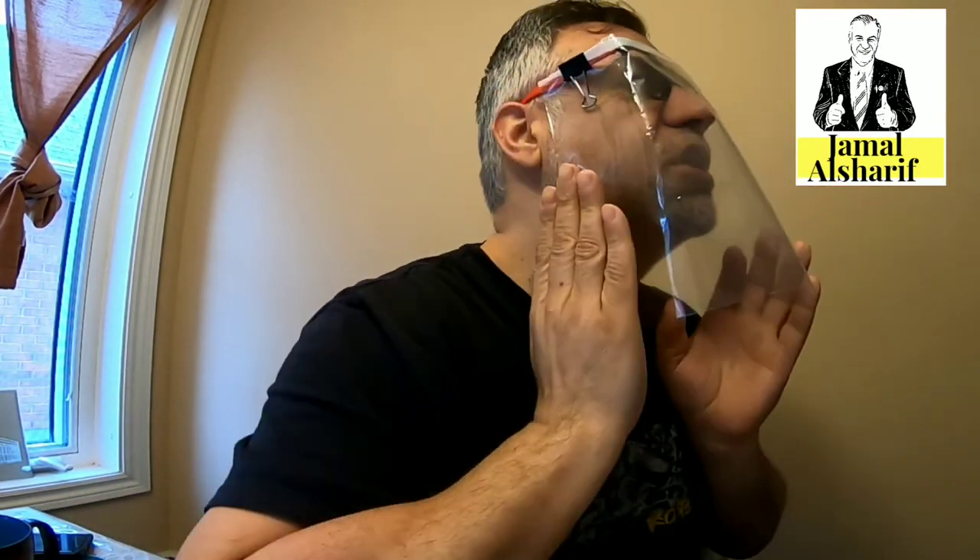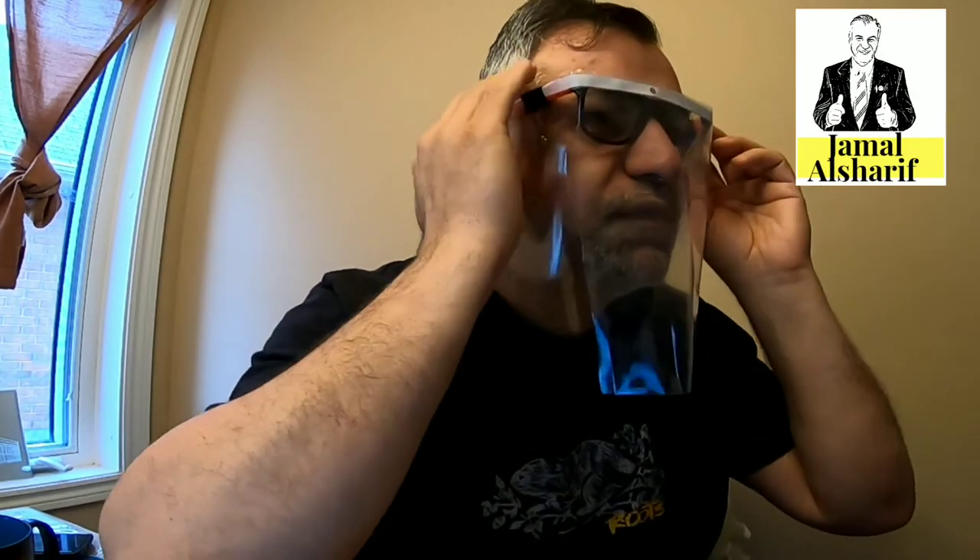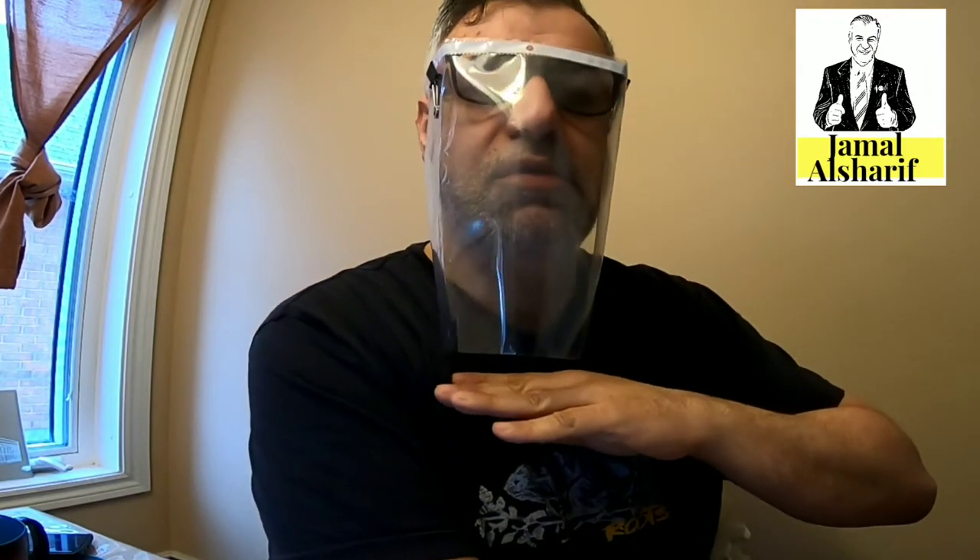This shield will not protect you 100% from viruses, but as you can see it shields your face — it's even better than the facial masks and shields we wear in hospitals, because it's very long, almost reaching your chest, and it covers you from the sides as well. However, there is still a space where the virus can get in.